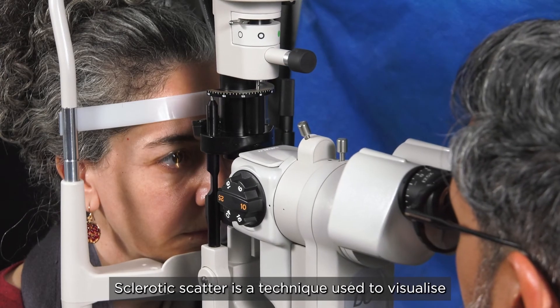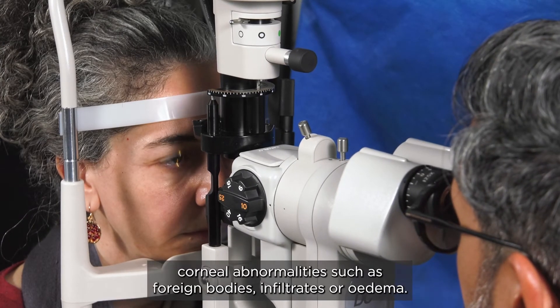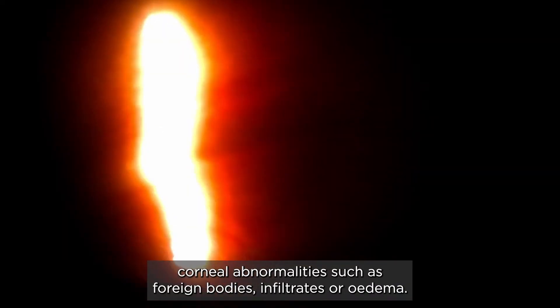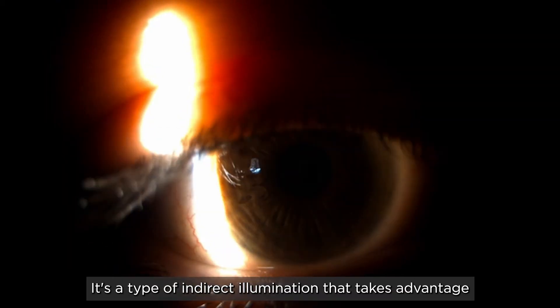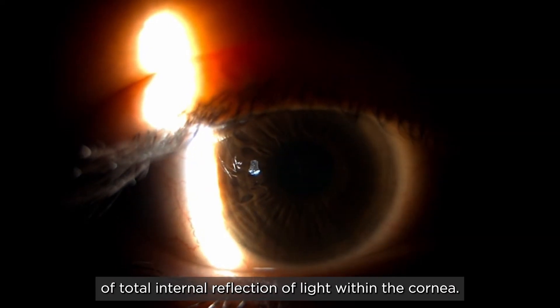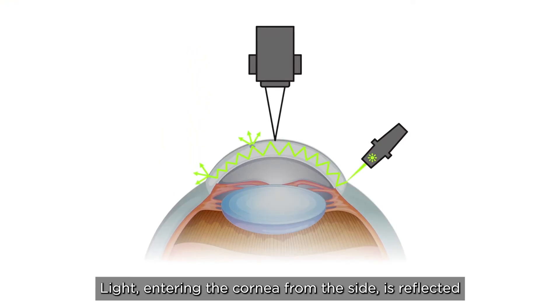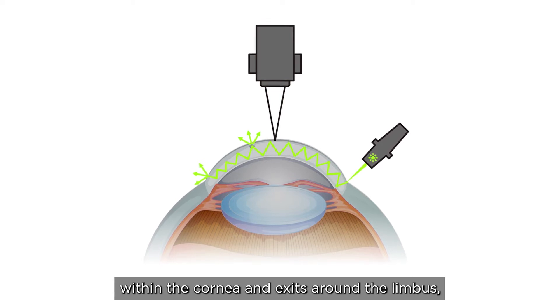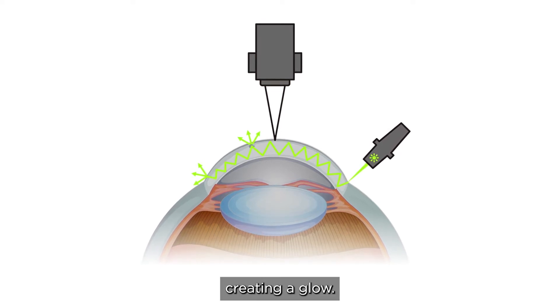Sclerotic scatter is a technique used to visualize corneal abnormalities such as foreign bodies, infiltrates, or edema. It's a type of indirect illumination that takes advantage of total internal reflection of light within the cornea. Light entering the cornea from the side is reflected within the cornea and exits around the limbus, creating a glow.